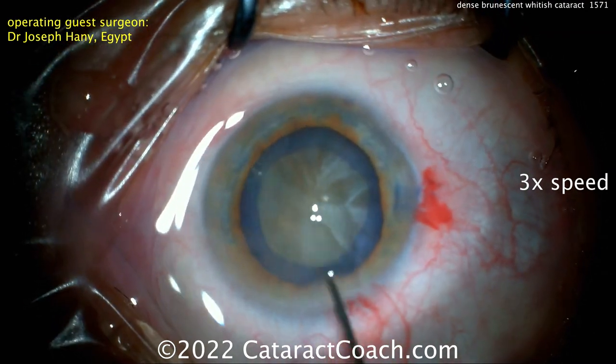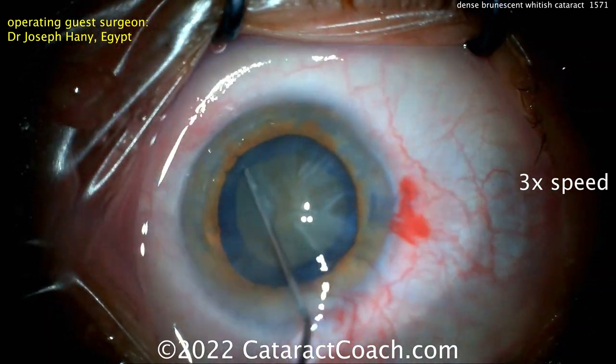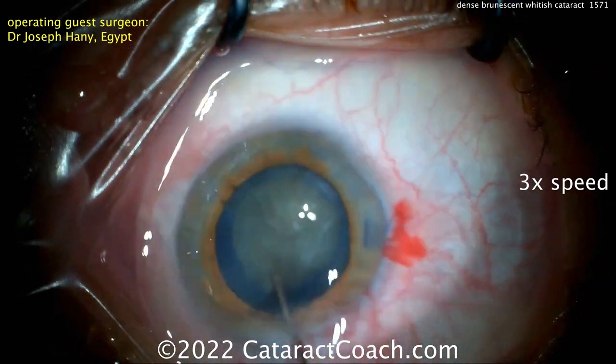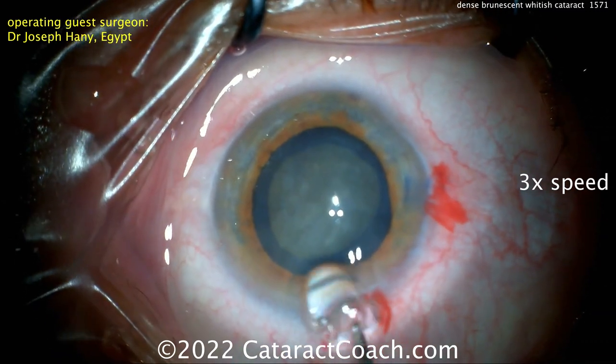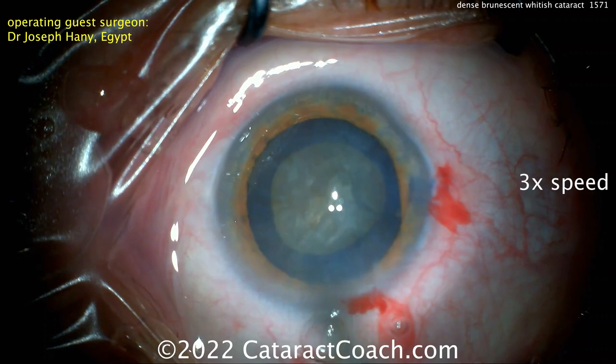Now during hydrodissection, slow and steady. Really be careful because you can't see the fluid wave go across — this cataract is so opaque that it's really hard to view that. Just a little fluid at a time, and then there you go — beautiful rotation. So good rotation there. A little bit more viscoelastic going inside the eye.